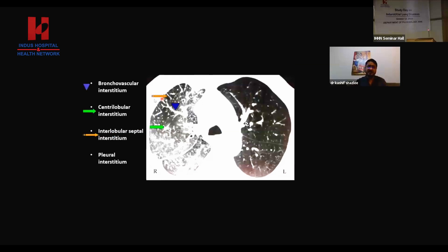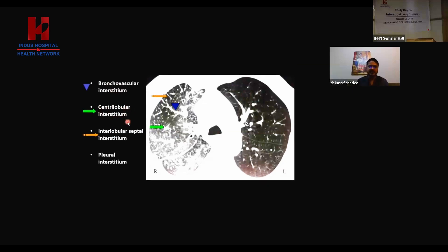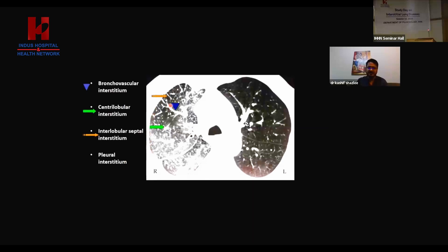There are four types of interstitium. Bronchovascular interstitium surrounding the bronchi and vessels — these are thick bands. The centrilobular interstitium within the secondary pulmonary lobule. Interlobular septal interstitium between two secondary pulmonary lobules. And pleural interstitium along the pleura. All of these are well established in the peripheries as compared to parahilar regions.